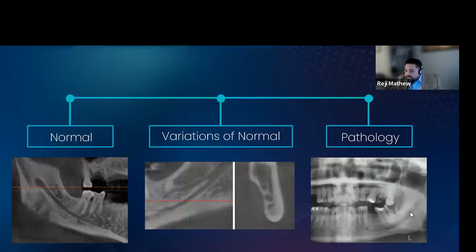Now, what do you do with this? You have to send it for an MRI. Here we are required to send an image. If you find something, you are required to send it to a physician for an MRI, and from there you probably get to look at an MRI. An MRI is great because it shows you soft tissue areas. Now the CBCT is great to see bone, but it does not have contrast resolution, or it does not show much of the soft tissue.